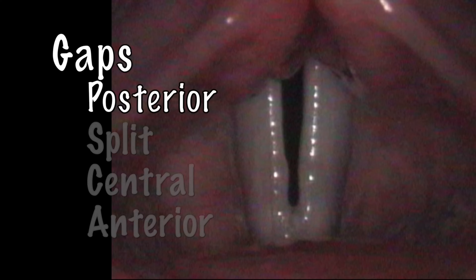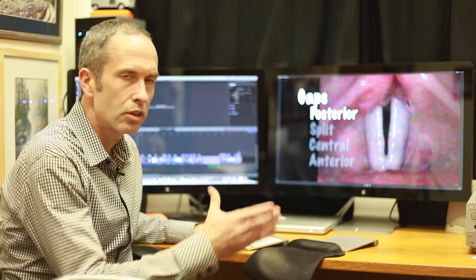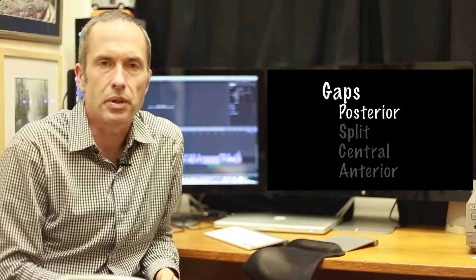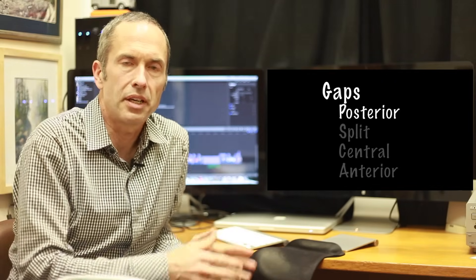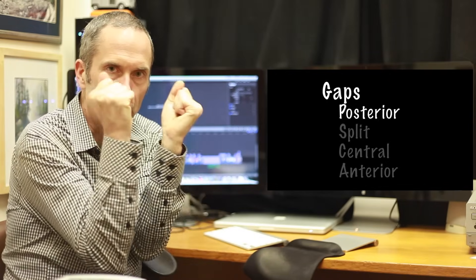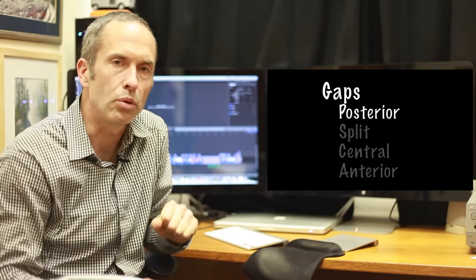Here's what posterior gaps would look like. They occur when the vocal cords don't come all the way together, and there could be several reasons why they don't come all the way together: paralysis or weakness, or the person has muscle tightness that doesn't quite bring the vocal cords together.